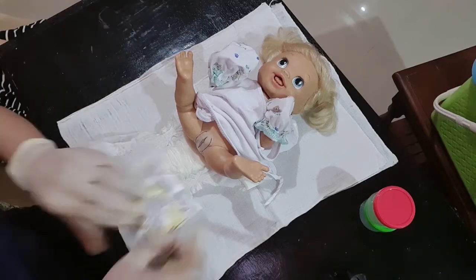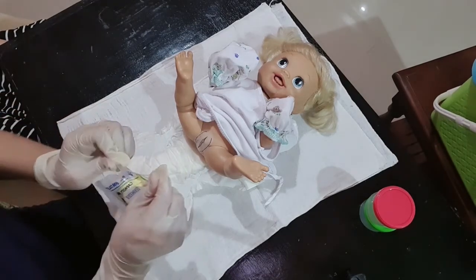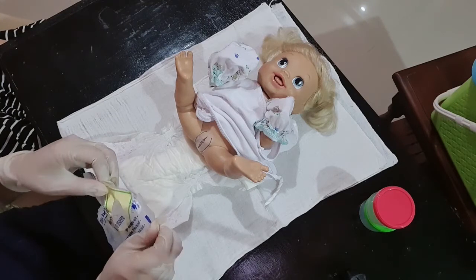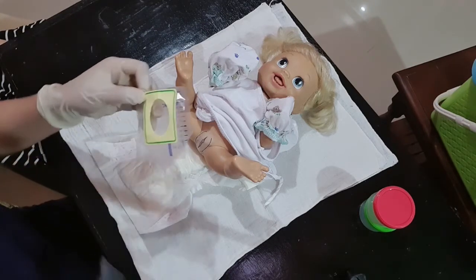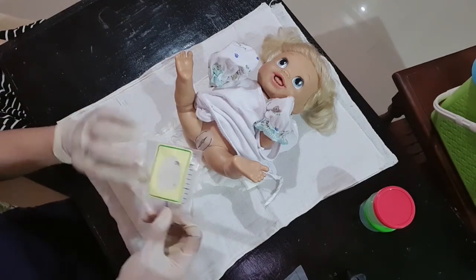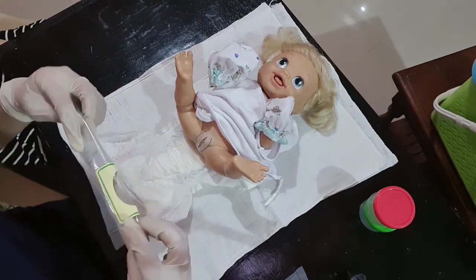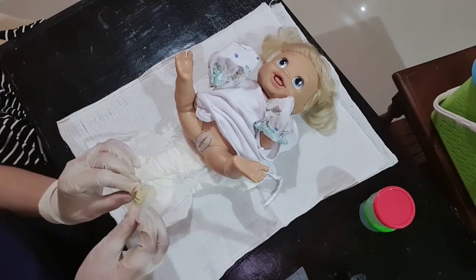Now I will be removing the wrapper of the wee bag. Make sure not to touch the inside part of the wee bag because that is sterile. Then, know the midline. Then peel off the protective paper.